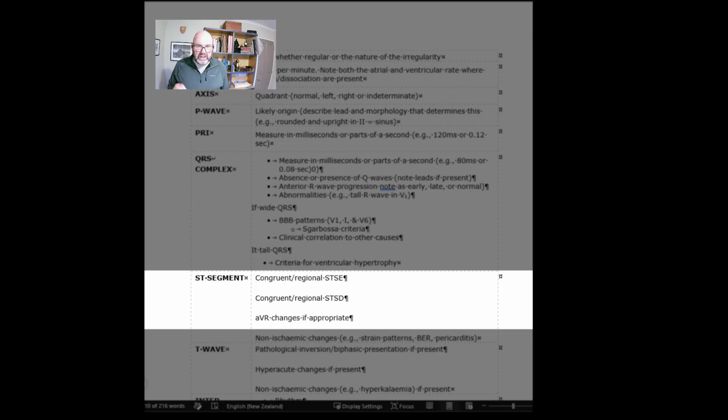When aligned with clinical or historical features that are given for a case, it can also help identify other pertinent features such as ventricular hypertrophy, STEMI mimics such as pericarditis, or other ion imbalances. And just remember, in the case where there was a wide QRS, these usual ST segment criteria are ineffective, and we have to think about things such as the modified Sgarbossa criteria.